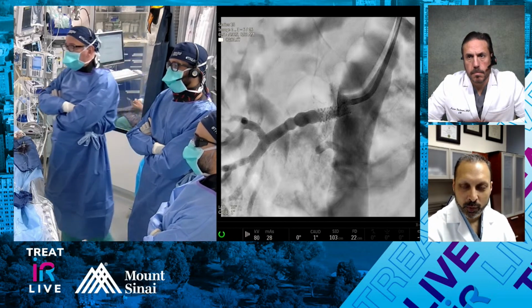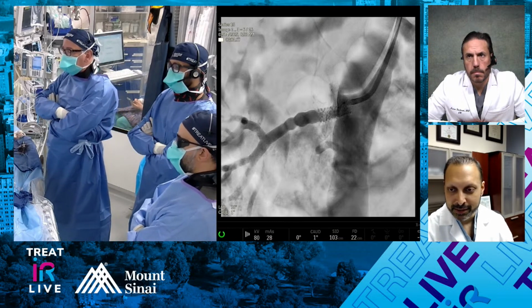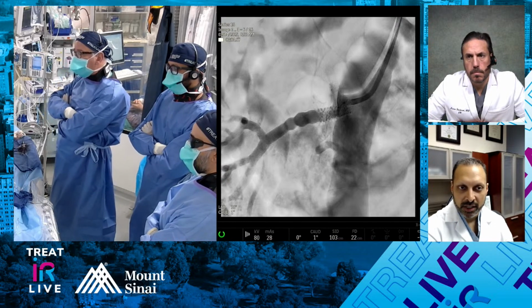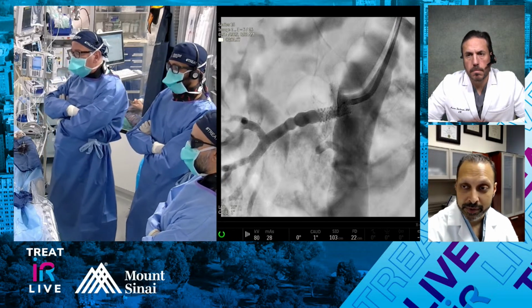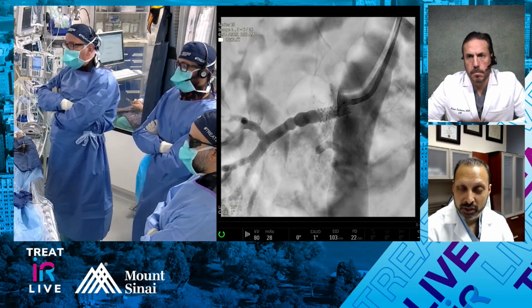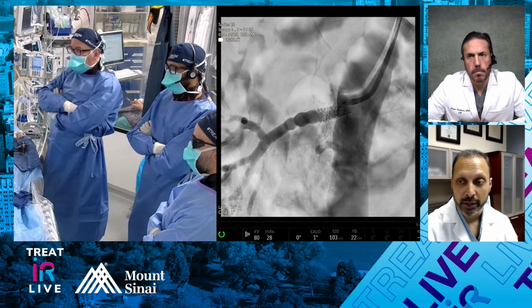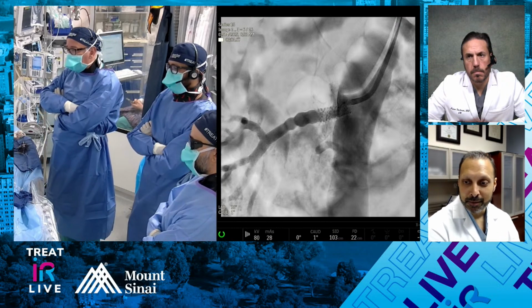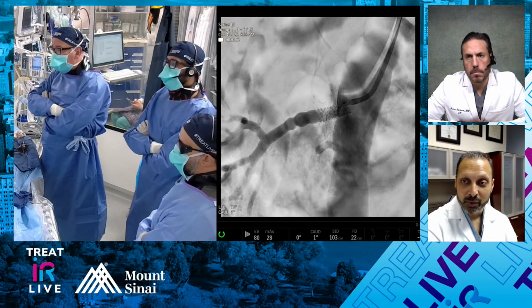We've moved to a lot of covered stents in the SMA, or in iliacs and CTOs. But for my renals, I tend to like uncovered. If I'm getting a standard 6 or 7 millimeter stent, it's traditional 0.014 platforms and bare metal stenting. When I get smaller, stent patency becomes a concern, and I've gone to drug-eluting stents. The only options typically are going to be our coronary stents. But we don't stock those. We have to grab them from our coronary lab, and they don't do a lot of peripheral. So typically a 5 isn't something we're going to always have available.